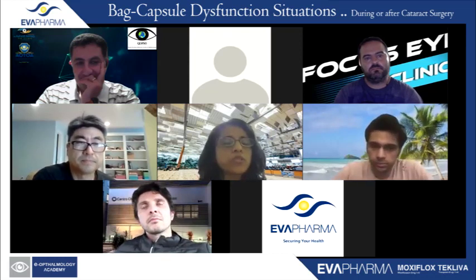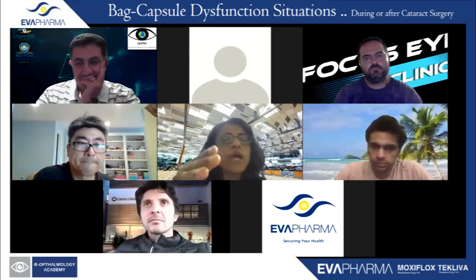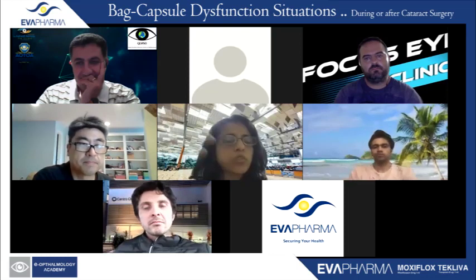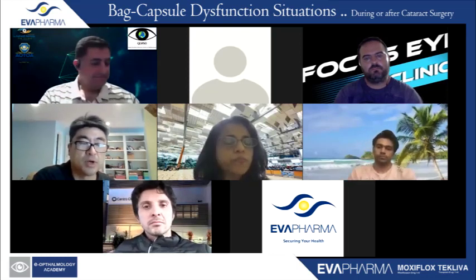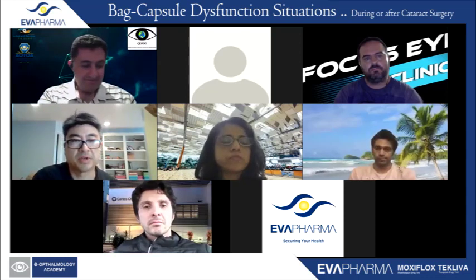Are you just trying to get that flange and then stop at that? Or are you also trying to shorten the haptics a bit so that your IOL moves a little anteriorly, so that you don't have to do that dioptric power correction? No, it's simply just to get enough of a mass effect so that it won't slip through the sclera.